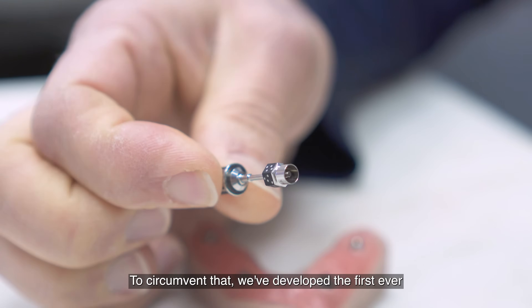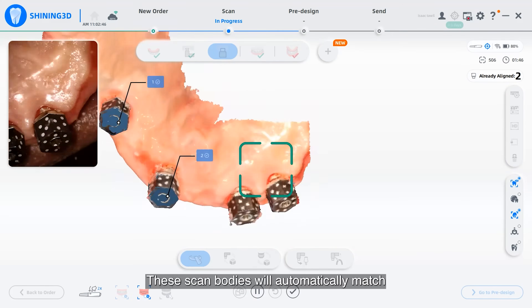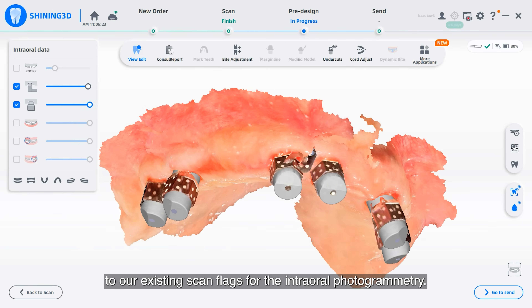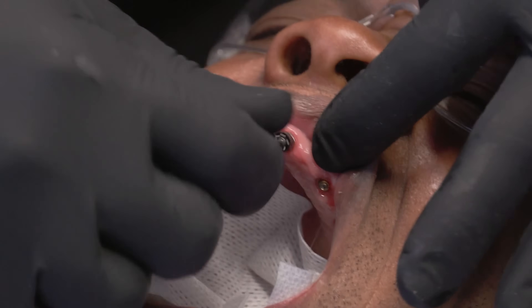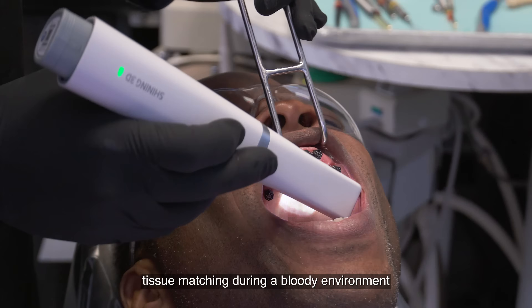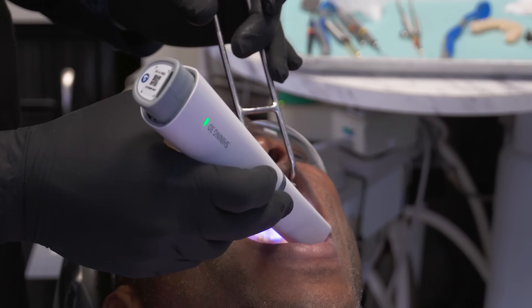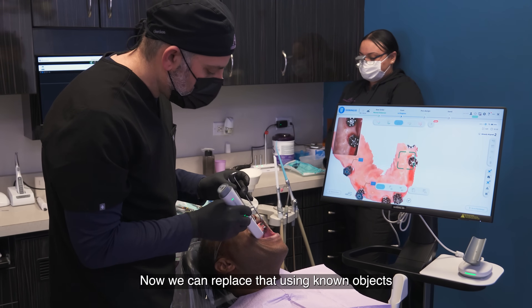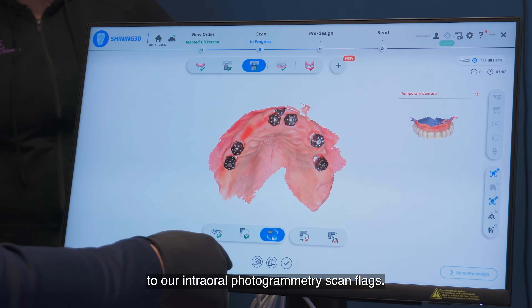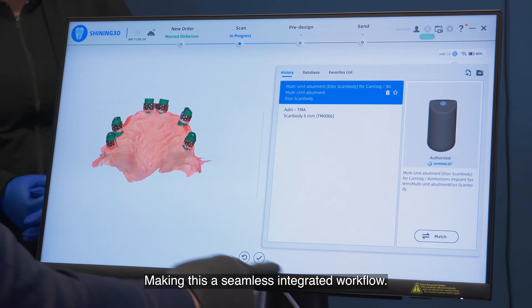To circumvent that, we've developed the first ever coded healing cap scan bodies. These scan bodies will automatically match to our existing scan flags for the intraoral photogrammetric. So no longer do we have to have tissue matching during a bloody environment to match our scan flags to our tissue. Now we can replace that using known objects — our coded healing caps — to match our intraoral photogrammetric scan flags, making this a seamless integrated workflow.